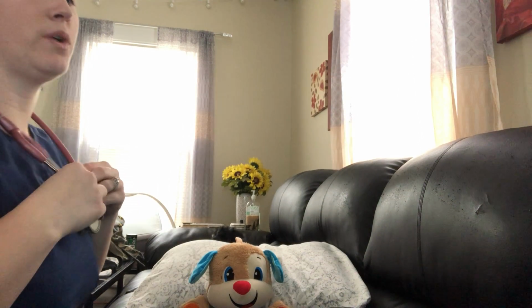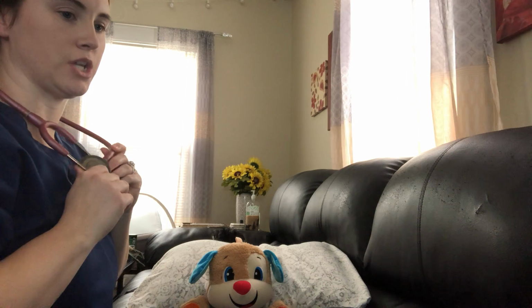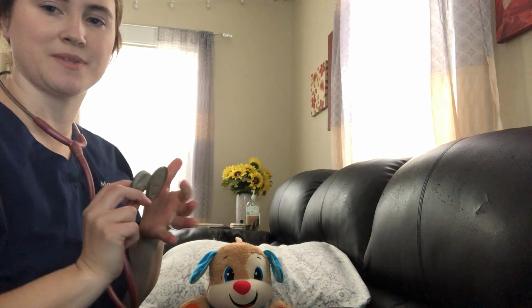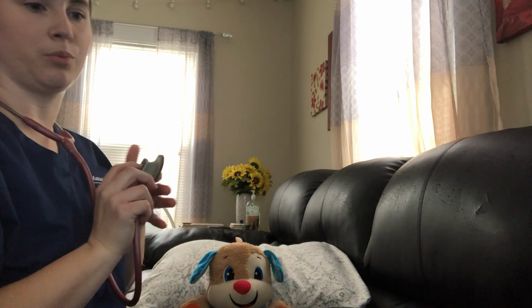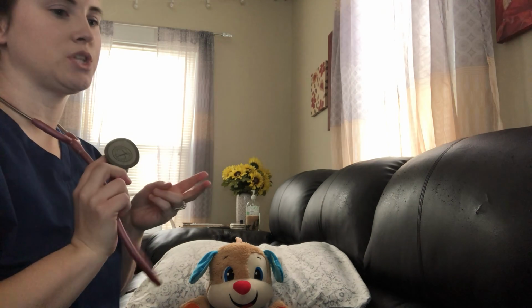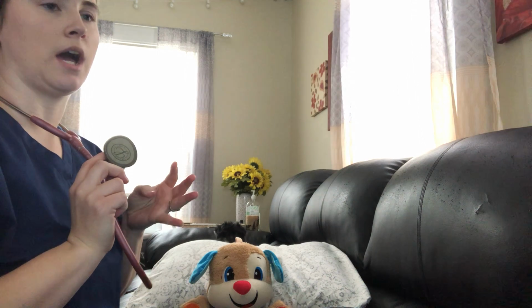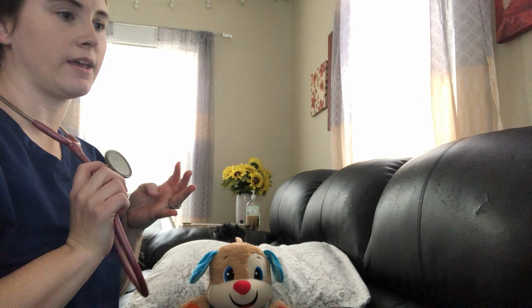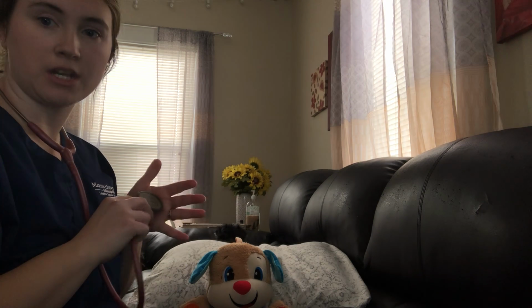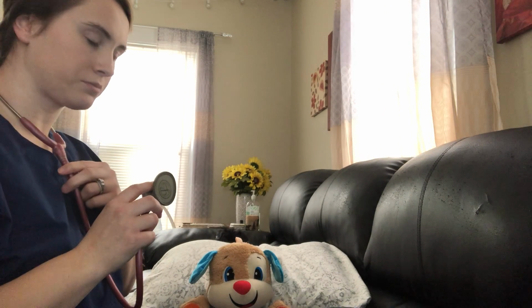Okay, and then I'm going to start auscultation. I'm not gonna actually put this on, but we should be using the diaphragm side of the stethoscope when we do these. We're listening for pitch, amplitude, duration, quality, and then what other one am I forgetting? And the normal location of each breath sound.